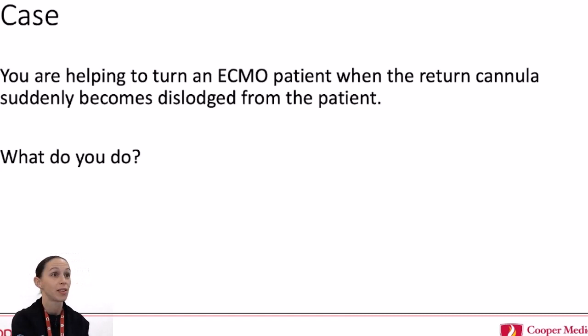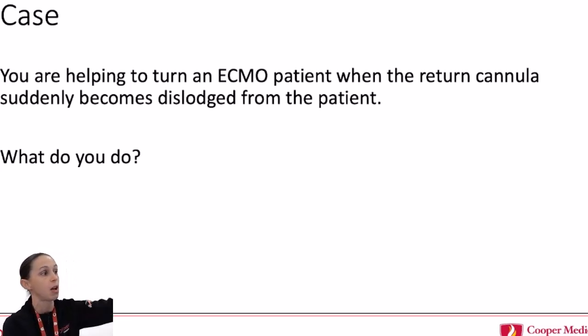So clamps, love it. So the first thing you do is, and I'll interject, we had a patient that had a similar scenario to this, and I'll intersperse parts of how that was handled. So the first thing you do is absolutely clamp, and call for help. I will never forget on a Saturday morning, rounding on bed 20, talking about probably tube feeds or something, when someone came out into the hallway saying, we need help down here, in a way that was very clear we had to run. And getting into the room, there was blood all over the walls. There was blood spurting out from the neck area and the end of the cannula.